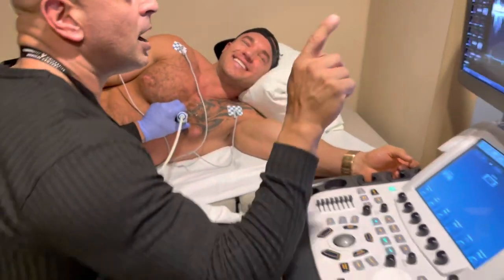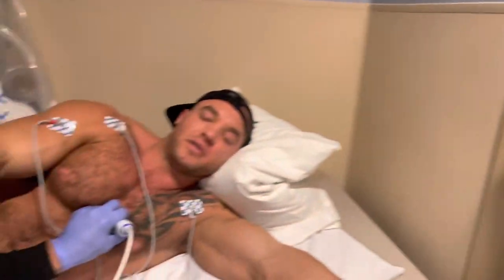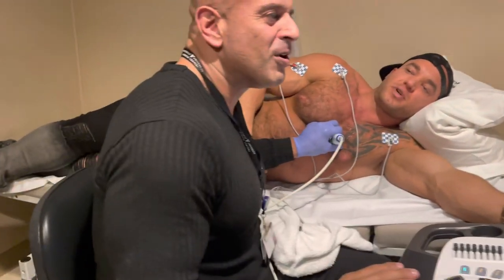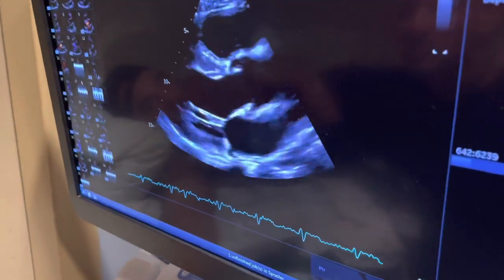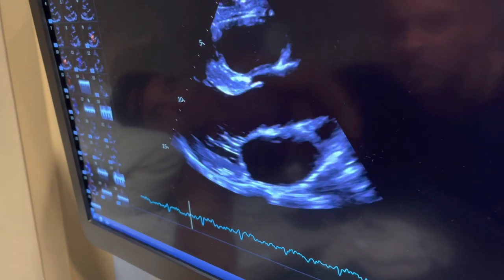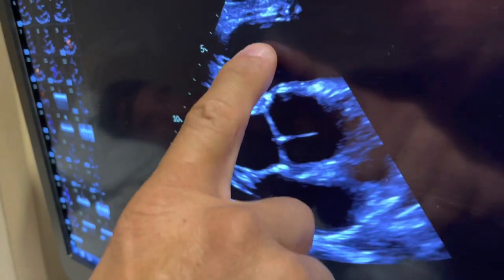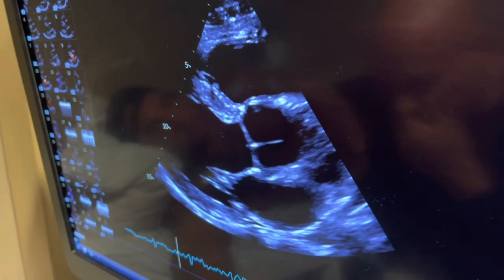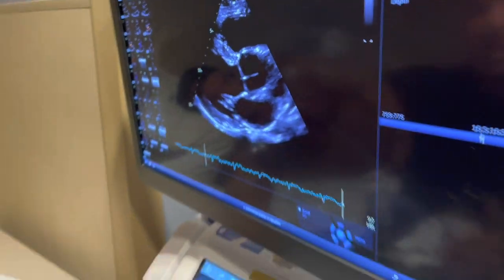Something to note with people that work out: when you look at this muscle here — this is called the septum between both ventricles — this muscle gets a little thicker. With people that lift heavy weights — not cardio — this muscle gets very thick.